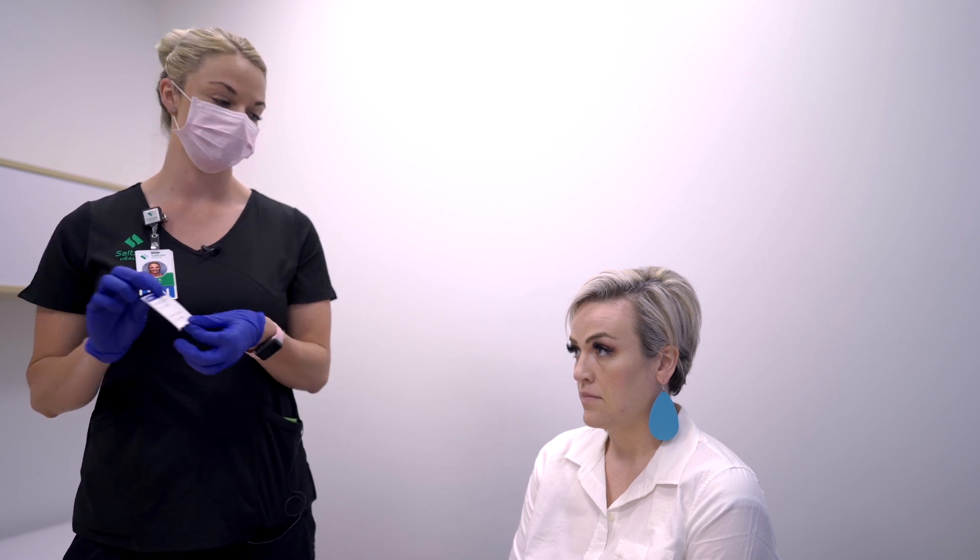Next you want to get a label for your patient that has their last name, first name, and date of birth, and verify this with the patient. Does this look correct? Yes.